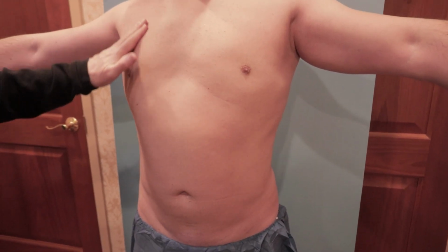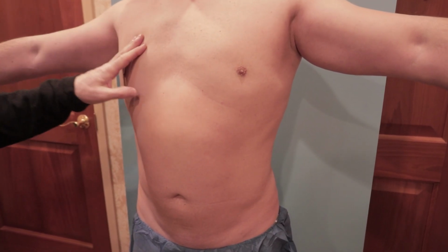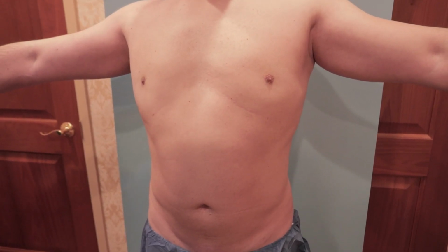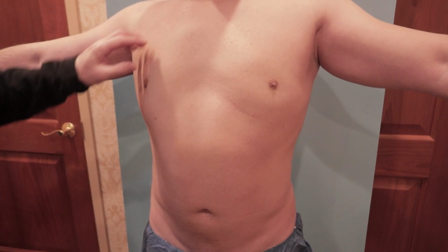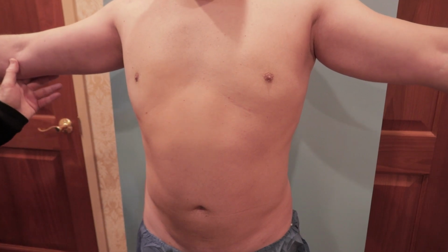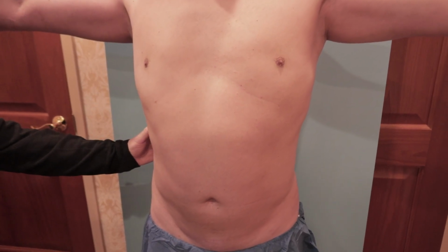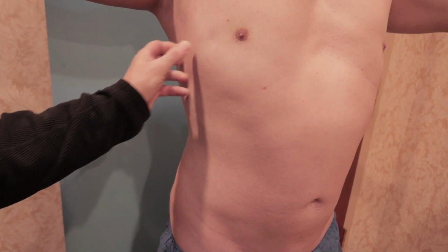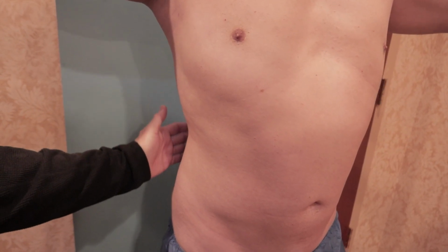He didn't want any lipofilling, but you know something? He's shaking his head, but I think we have to do it. We don't have to go crazy. You don't have to put 250 in him, but a little bit of pop, especially since he had this, to really accentuate and lift up the chest. Obviously, going to the lats, it's, again, all about the muscle definition. Put some shadows here and some light here, etch the lats.